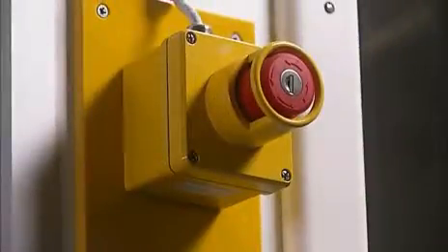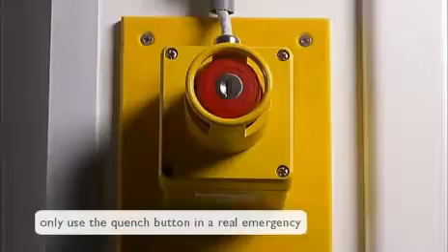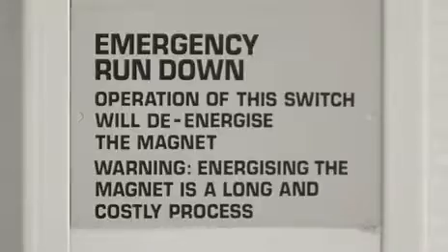In an emergency, press the quench button. This will switch off the magnetic field within about 20 seconds. This must only be done in the case of a real emergency, when switching off the magnet is urgently needed. Bringing the magnet back on field is a very expensive and time-consuming procedure.